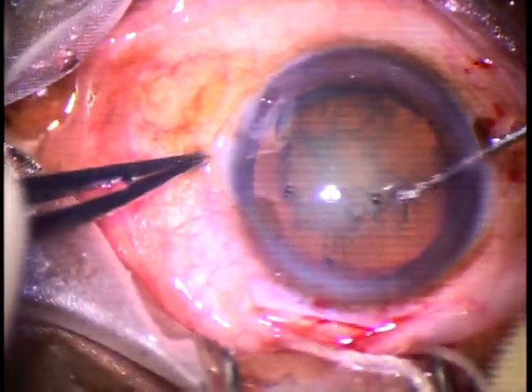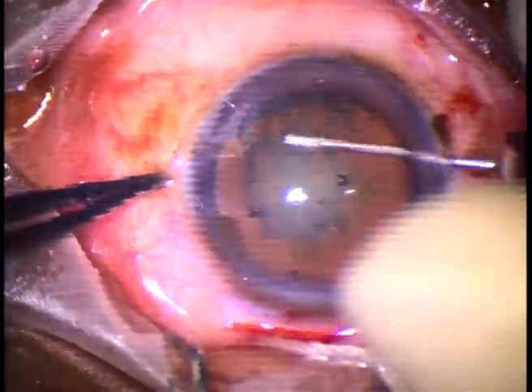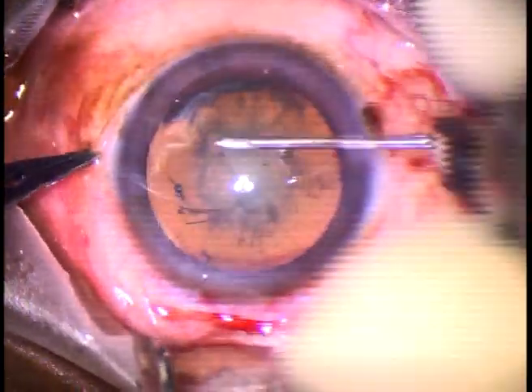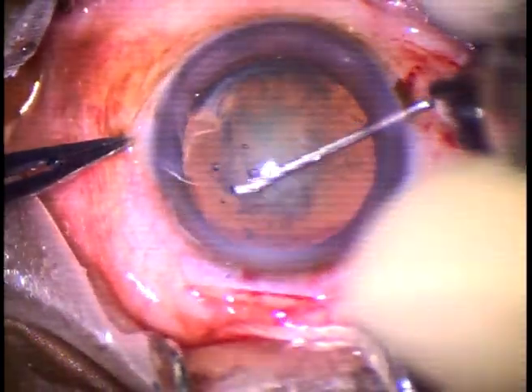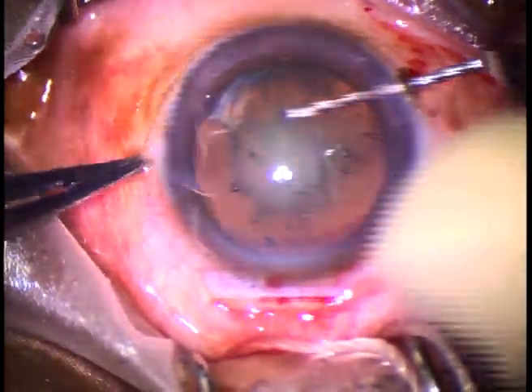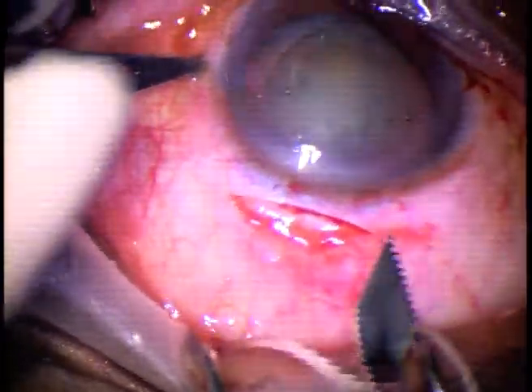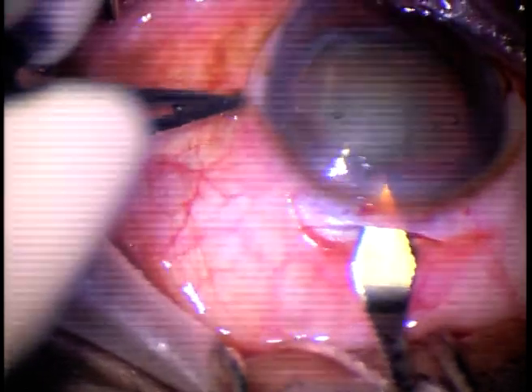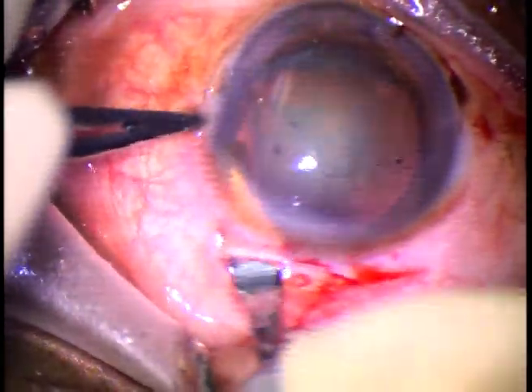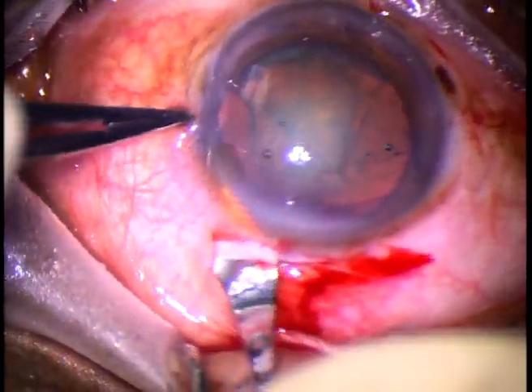The anterior chamber has been filled with 2% HPMC. A flap is raised, a capsular tag is raised, and this tag is guided all around to do a continuous curvilinear capsulorhexis. The size of this rhexis is about 5.5 to 6 millimeters. In SICS, if the nucleus is hard, the rhexis should be large; if the nucleus is soft, it can be small.